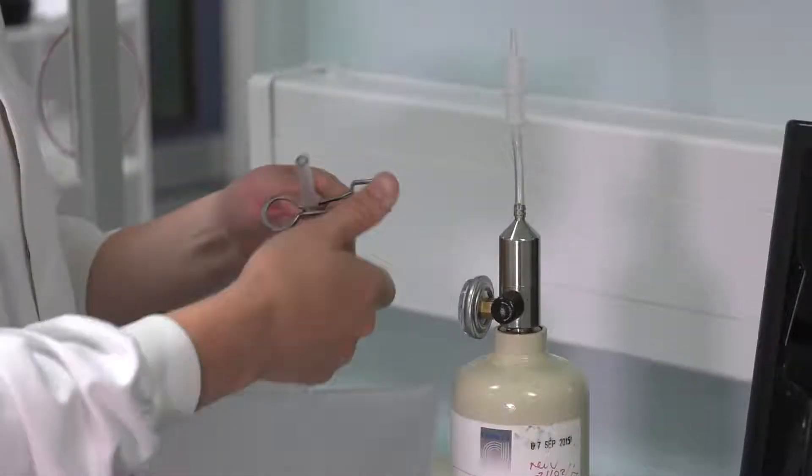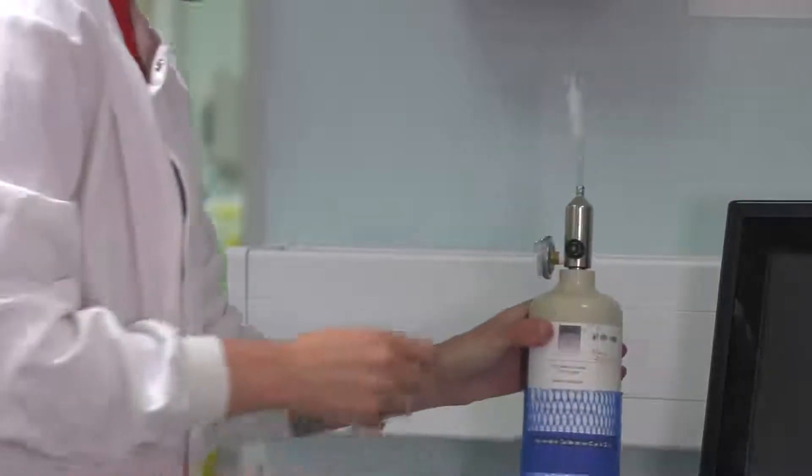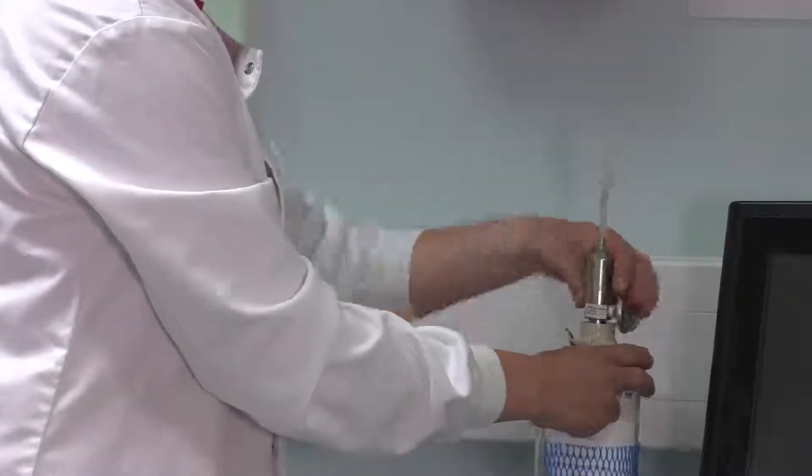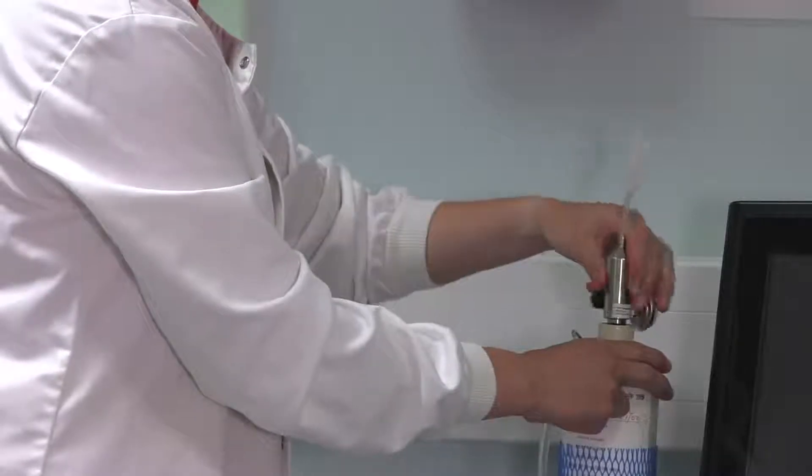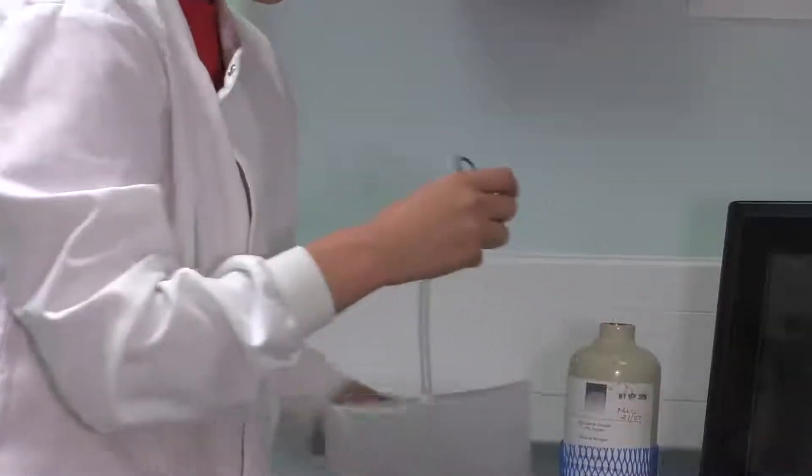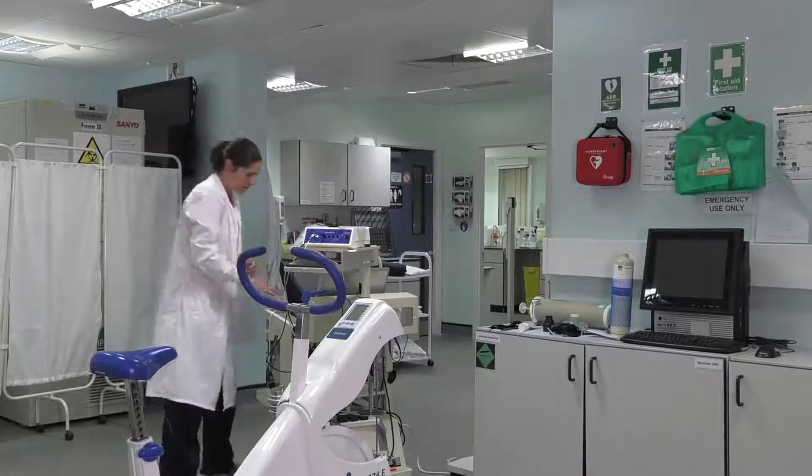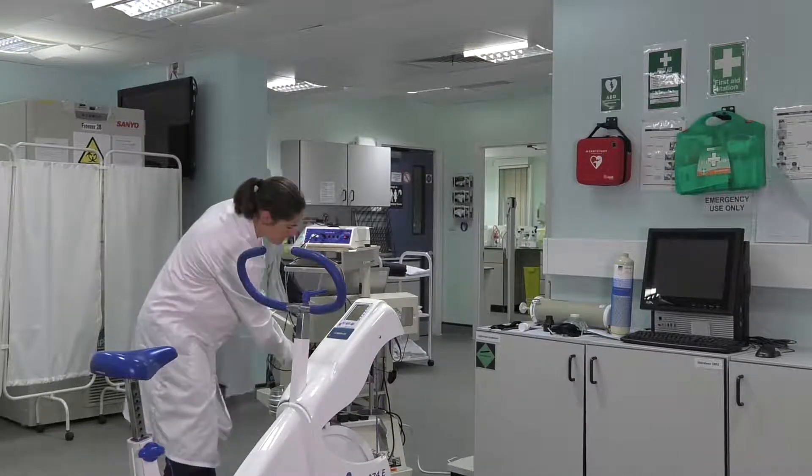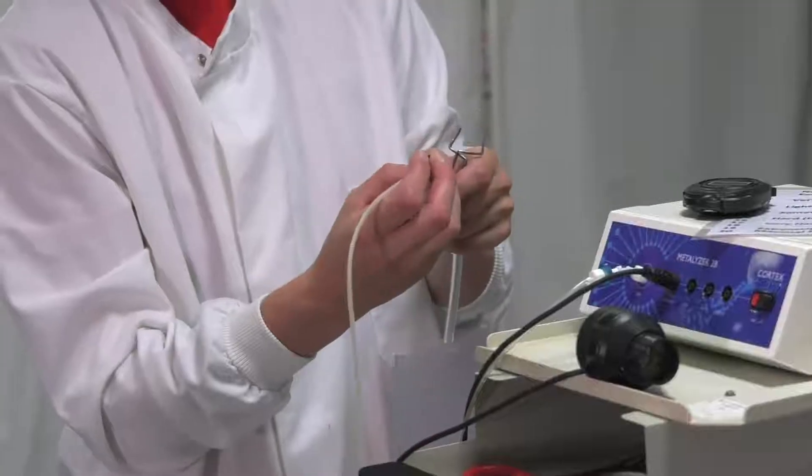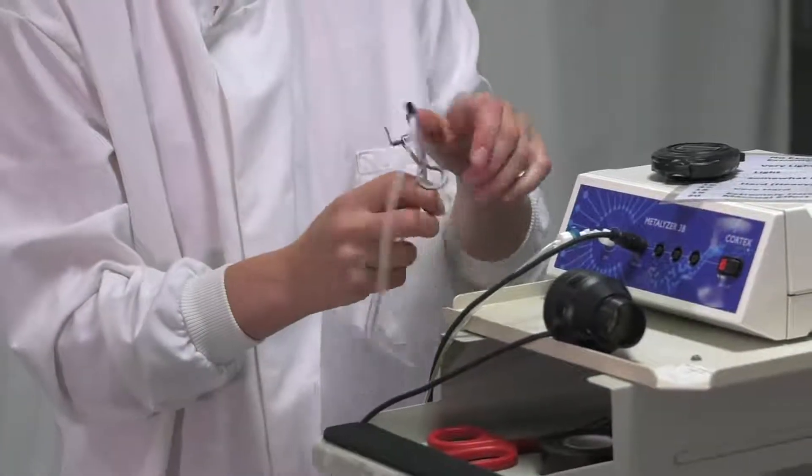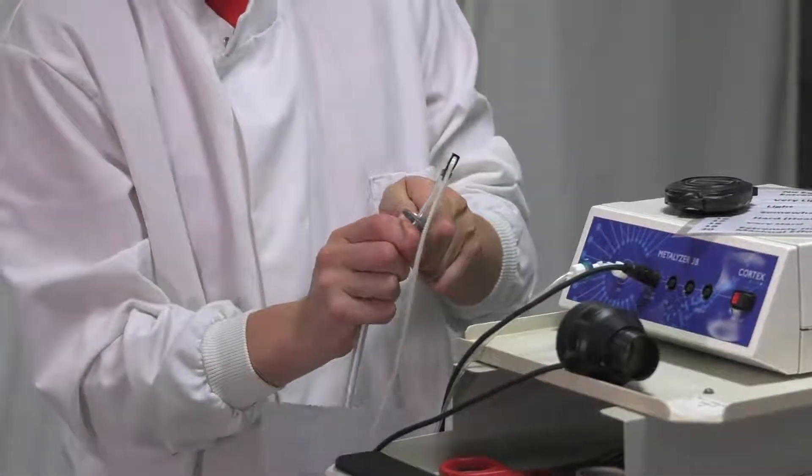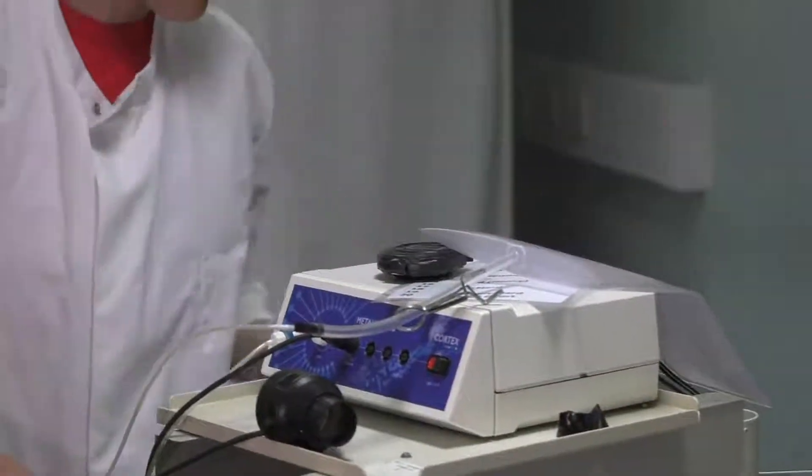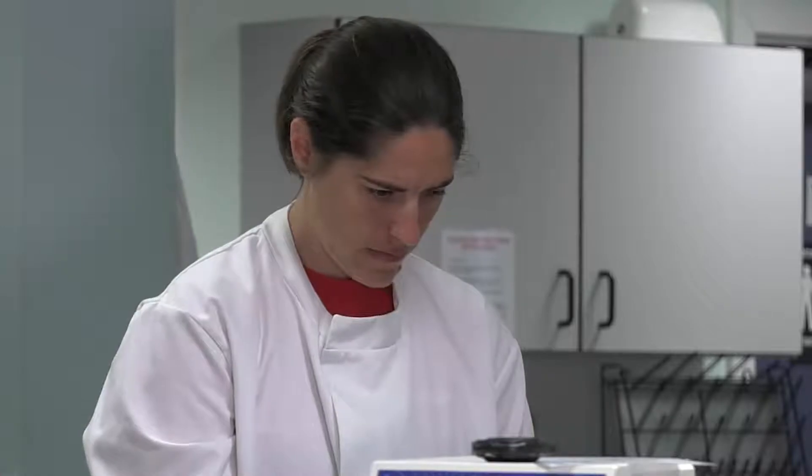Take the valve off the cylinder so that the gas does not escape. Take the filled bag back to the gas analyzer and place the sample line into the tubing of the bag and release the stopper. Then back to the computer click on start gas 2.